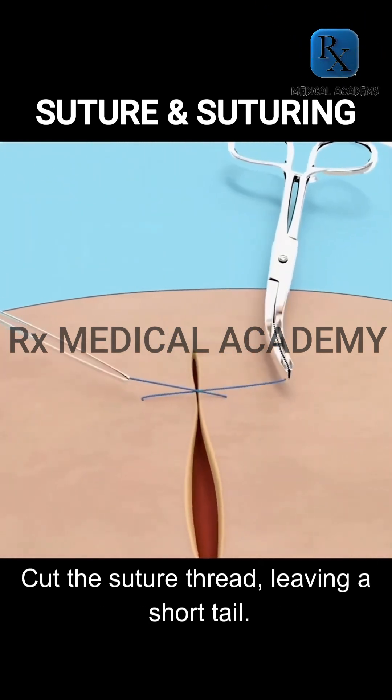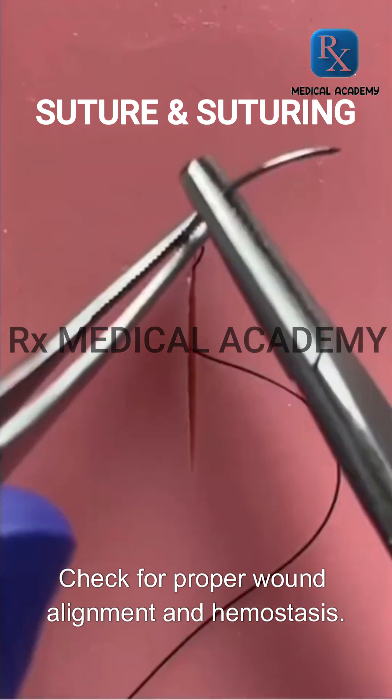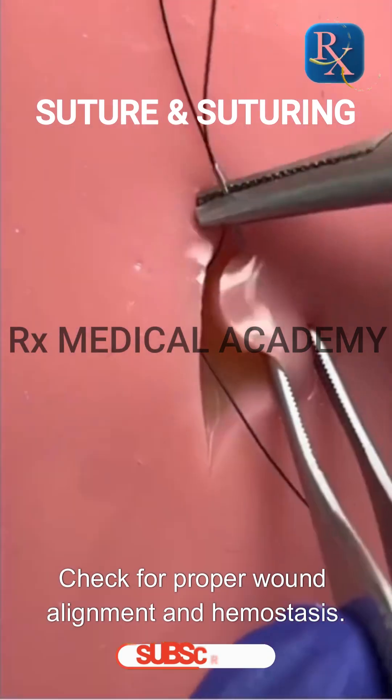Cut the suture thread, leaving a short tail. Check for proper wound alignment and hemostasis.